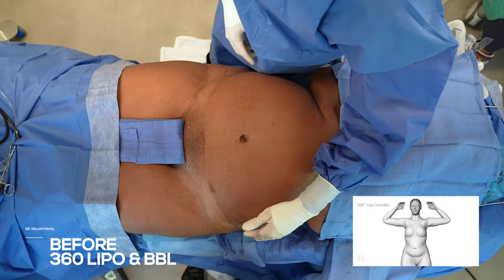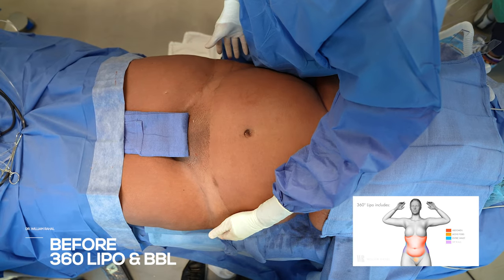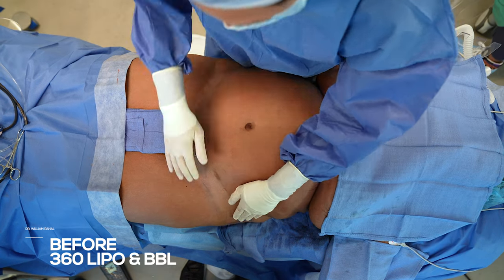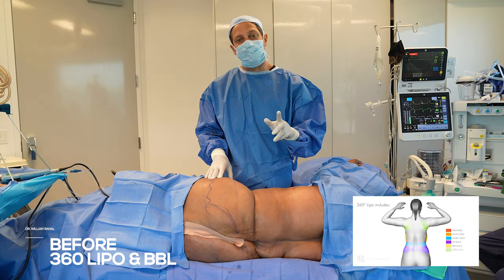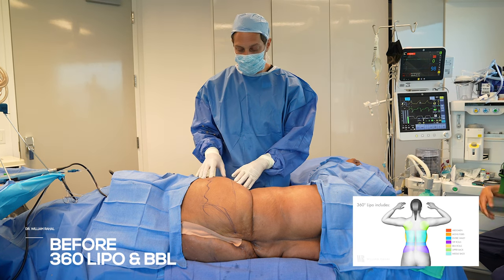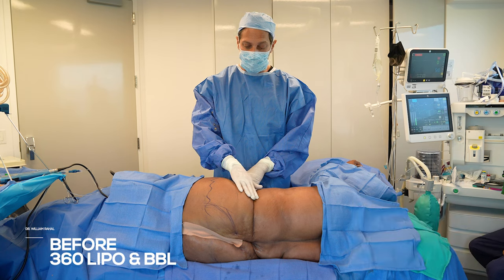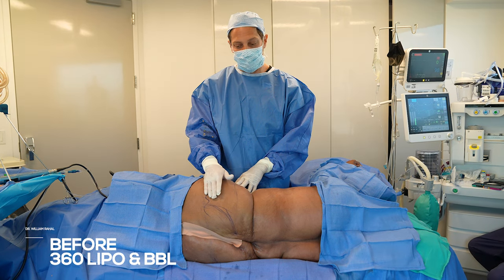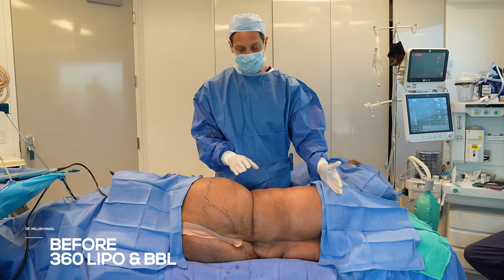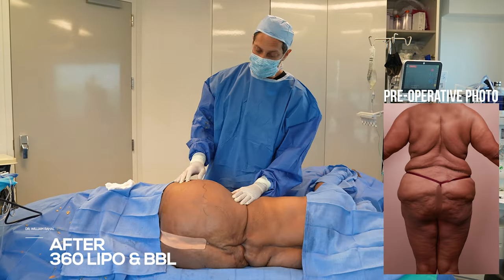We're going to do our 360 fat transfer. She has interesting anatomy — there's a lot of contouring involved where we have to bring in the hip roll and then expand the thigh. Some of the anatomic challenges: one, there's a lot of cellulite, which makes it harder to expand; two, the lower back skin goes to the halfway point of the buttock; three, there's loose skin. We're going to lipo from here to here, expand the buttock, and build up the thigh.